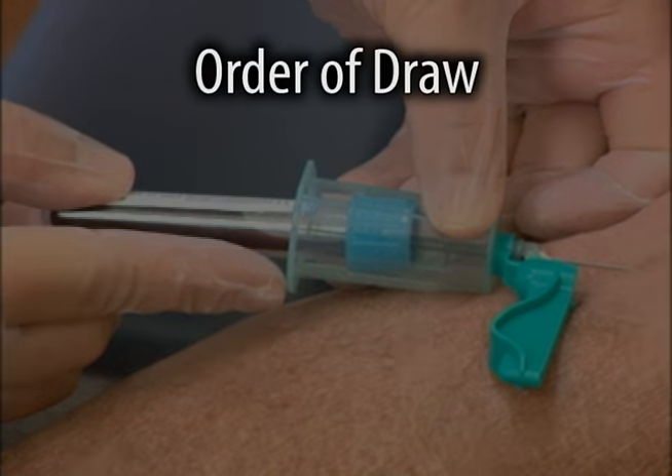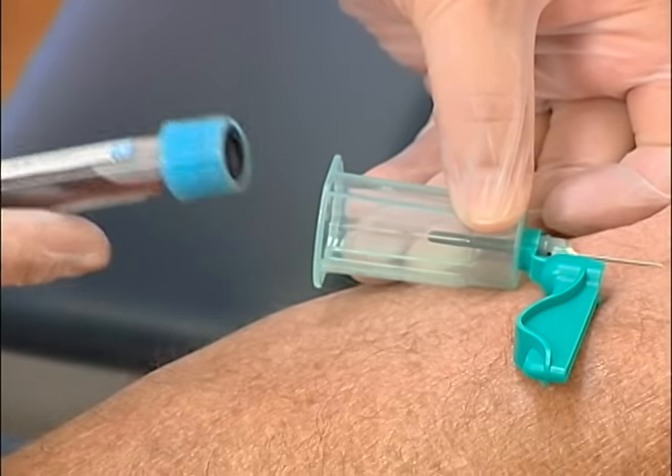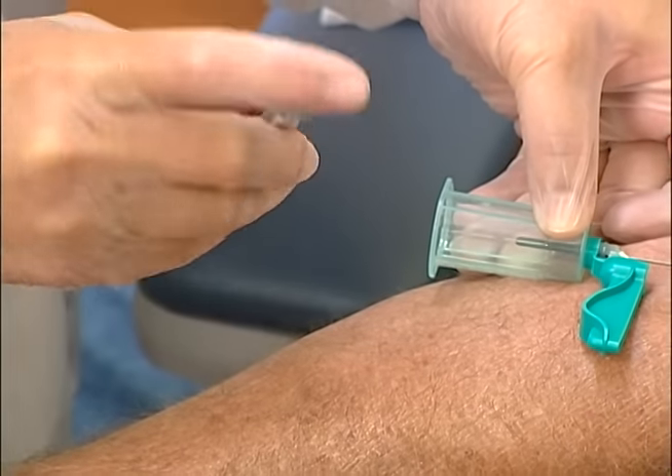Apply the remaining tubes in the prescribed order of draw. Remove and invert each tube with an additive five to ten times after filling to provide proper mixing with the blood.